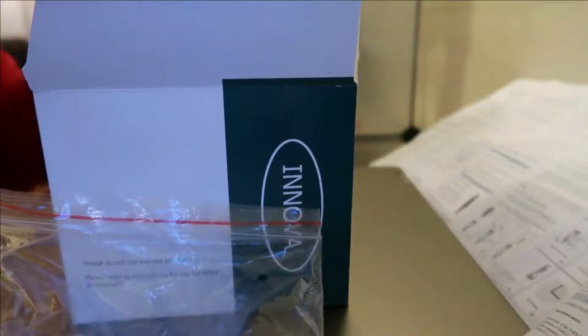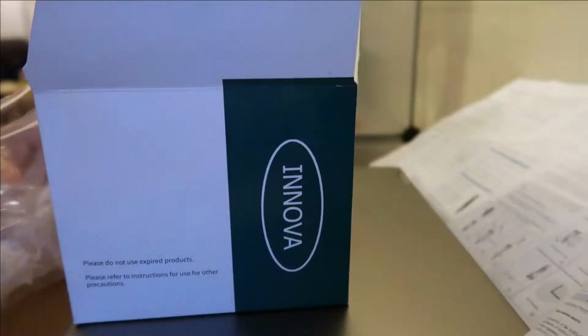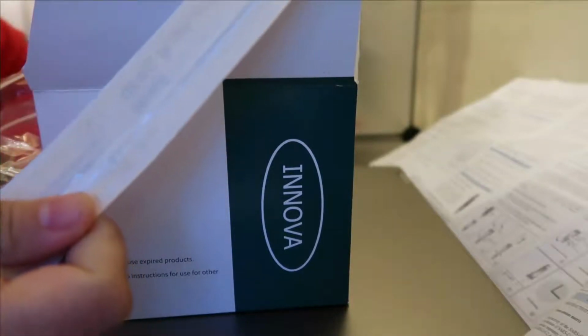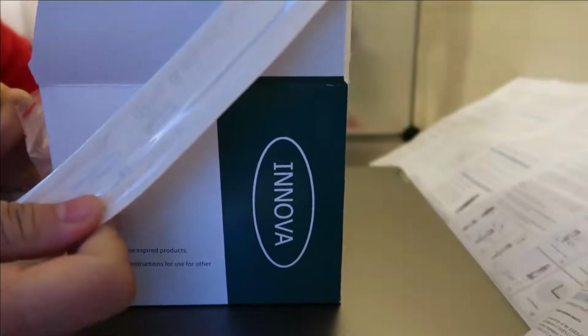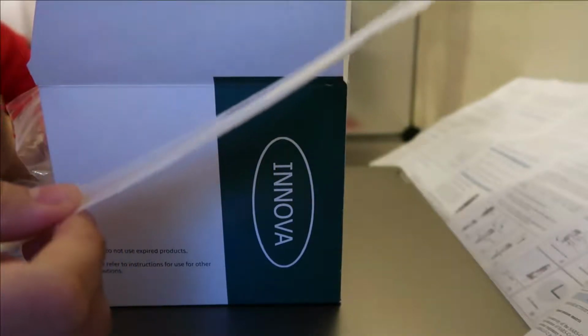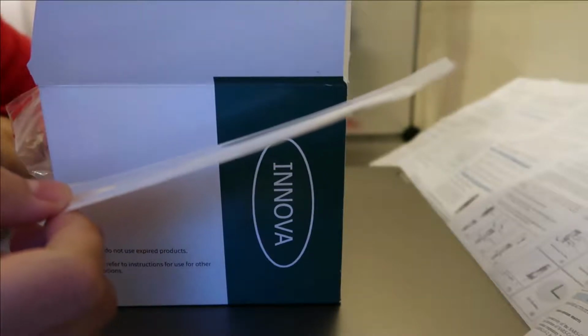So I've shown you the things inside, and the second part is doing the test itself. What needs to be done is that first you need to swab yourself. I actually asked the question whether I need to wear something, and this is a clean technique, not an aseptic technique. That means it doesn't have to be sterile, but it is necessary to follow the warnings of what you should not touch, like the edge of the swab or something like that.